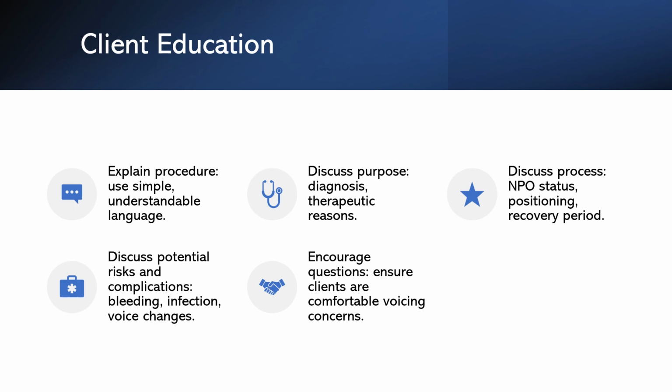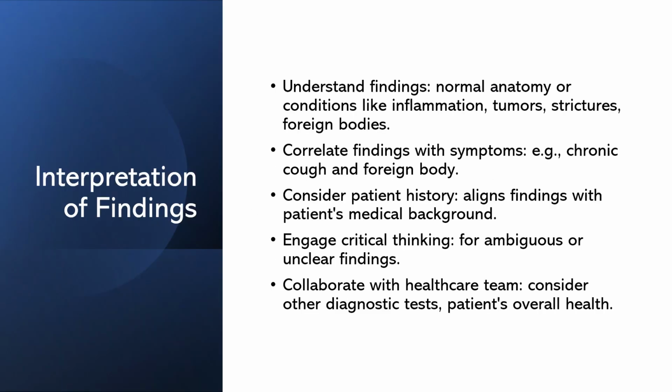We should make sure our clients feel comfortable asking questions and voicing their concerns. Client education is all about communication, empathy, and respect. Now that we've discussed the procedure and how to prepare our patients, let's turn our attention to the critical task of interpreting the findings. Findings from a bronchoscopy can reveal a lot about a patient's respiratory health.